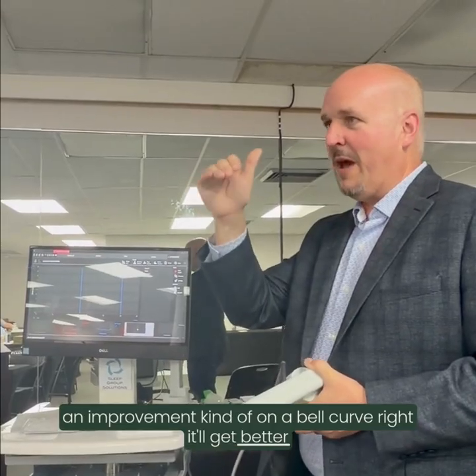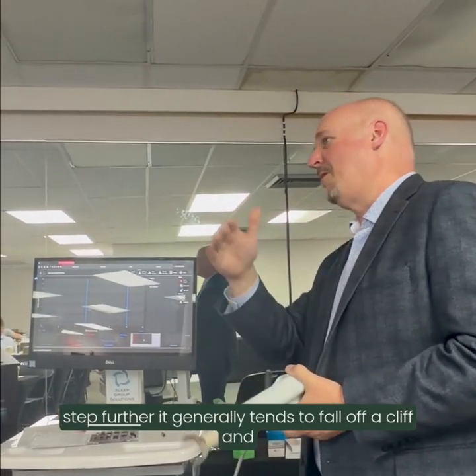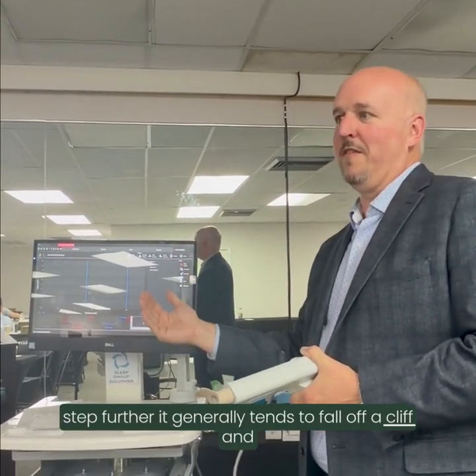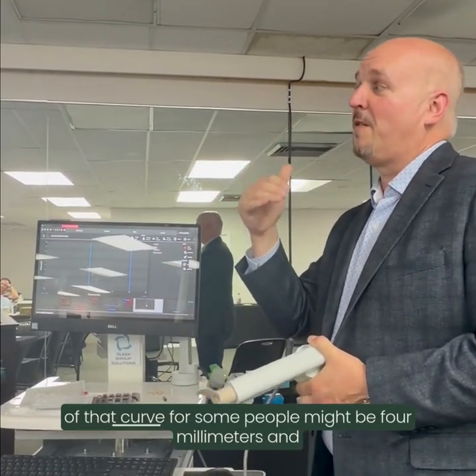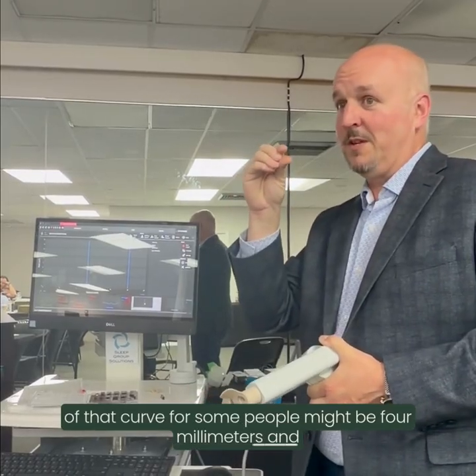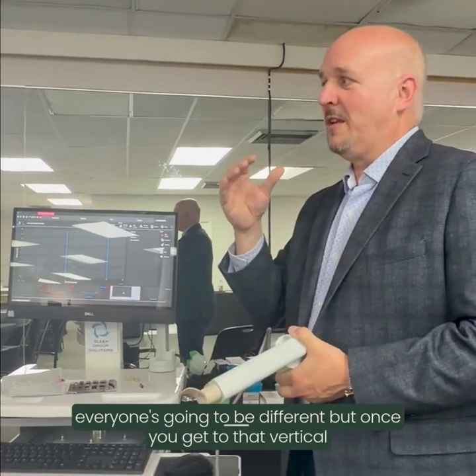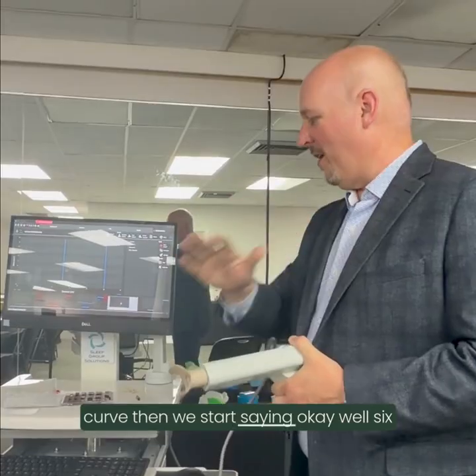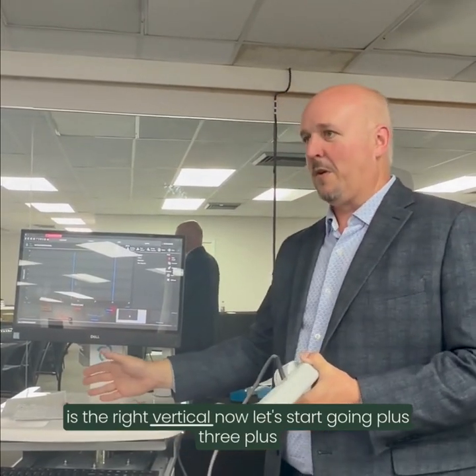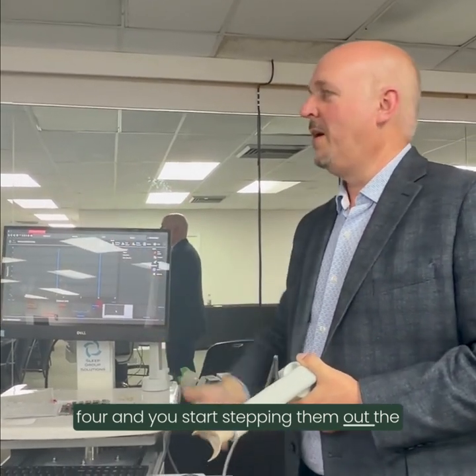It'll get better to a point, and then if you go one step further, it generally tends to fall off a cliff. So go to the top of that curve. The top of that curve for some people might be 4 millimeters, and for me it's 10. Everyone's going to be different. But once you get to that vertical curve, then we say, okay, 6 is the right vertical. Now let's start going +2, +3, +4, and you start stepping them out.